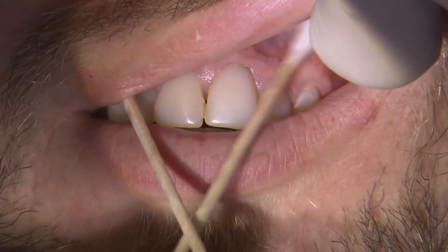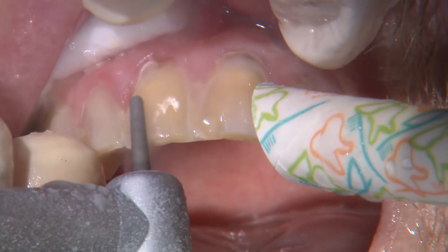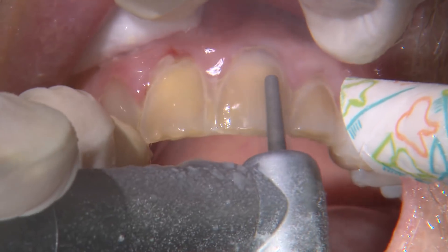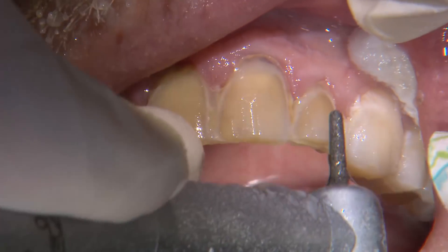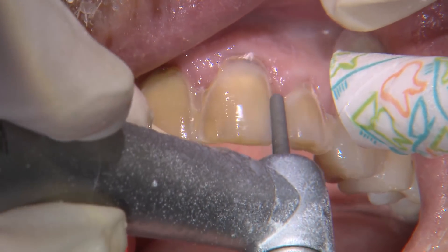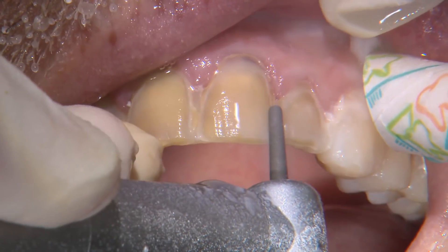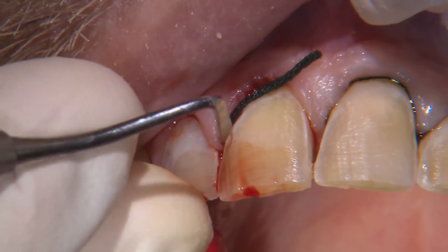We will now begin the procedure with local infiltrations to ensure our patient is comfortable. Starting with a coarse grit round-ended tapered diamond, I first place vertical depth cuts through the old composites until I reach tooth structure. Since the teeth are in good alignment with the labial surfaces near where we plan on restoring to, the goal is to achieve an even amount of reduction along teeth seven through ten. I'm aiming for a half-millimeter chamfer at the margins, increasing that reduction to about 0.8 millimeters along the middle and incisal thirds.